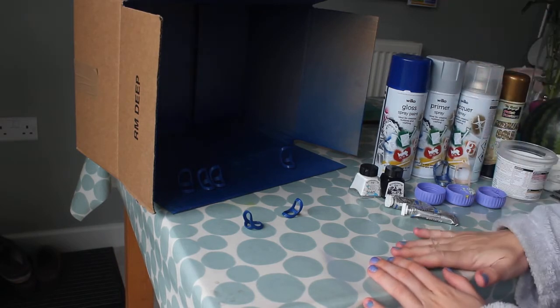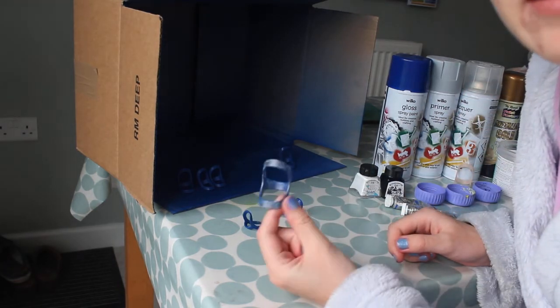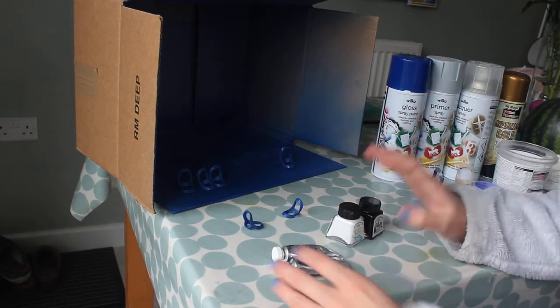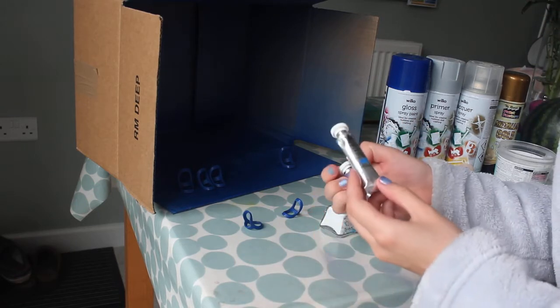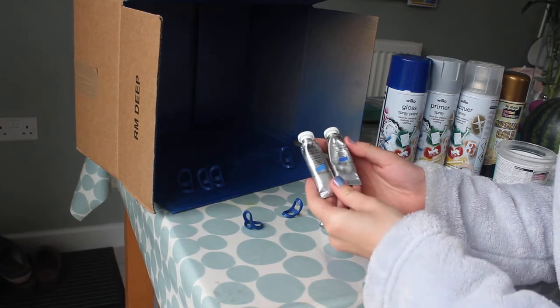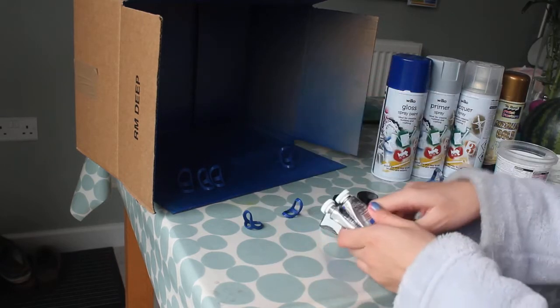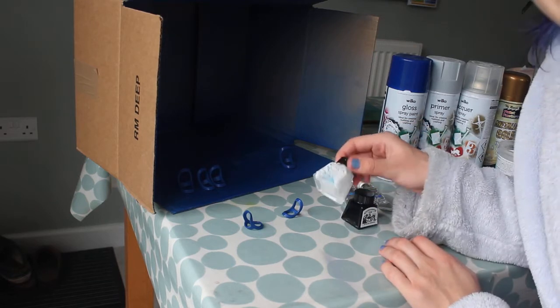But what I'm going to do is, as I showed you the little example I did, I'm going to paint the faux marble effect. So for that I'm going to use paints I've just got out of my paint set. So I've got a couple of tubes of gouache in primary blue and ultramarine, which is really similar to the colour I sprayed the ring splints, and then I've got a black ink and a white ink.